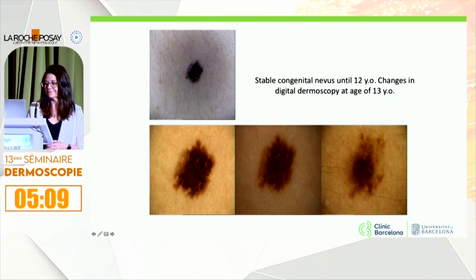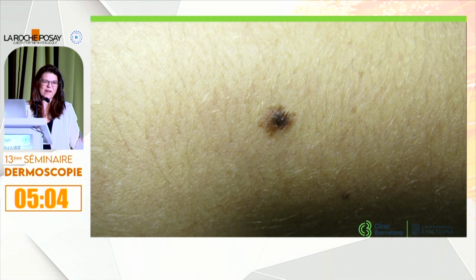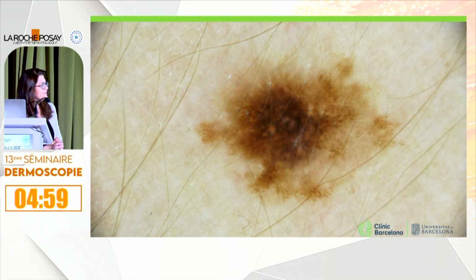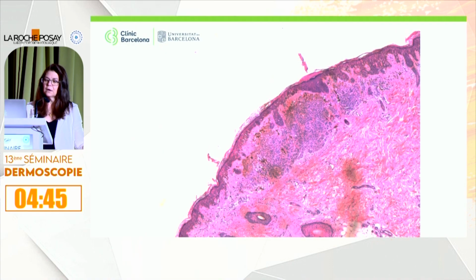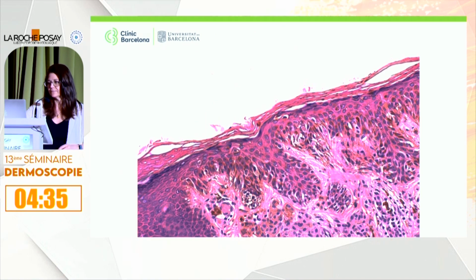This is the clinical image. It's true, it's irregular, but it's a congenital nevus. And dermoscopy, again, it's strange. And the mother told me that it's growing, and I see that it's growing. You see this reticulation, asymmetry, gray color, what we are going to do? Excise, of course. And again, a melanoma arising in a congenital nevus, a small congenital nevus. It's rare, very rare, but again, it exists. And this is histology.